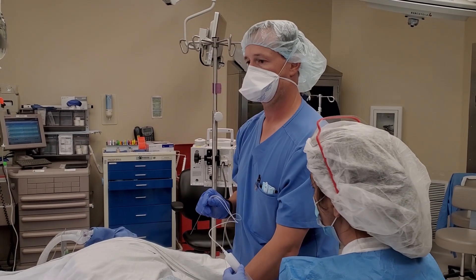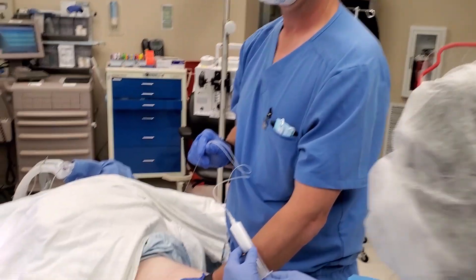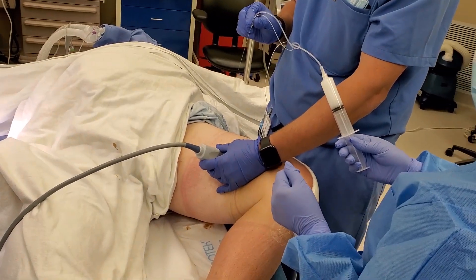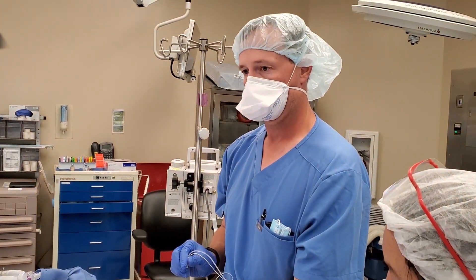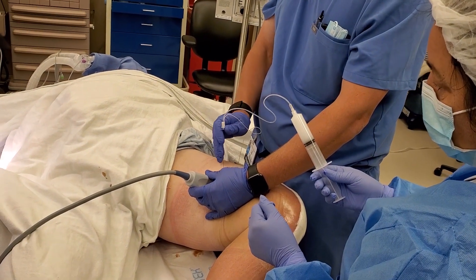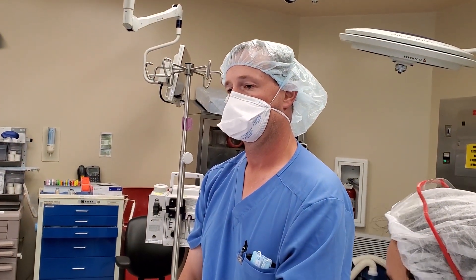I'm here with Dr. Miller with Metropolitan Anesthesia Consultants. We are doing an adductor block after a total knee arthroplasty. Dr. Miller, why are we doing an adductor block instead of a femoral artery block or femoral nerve block?